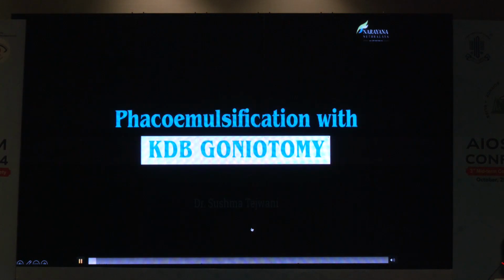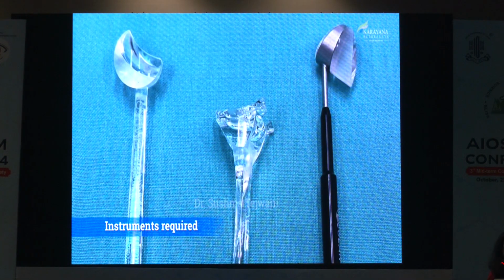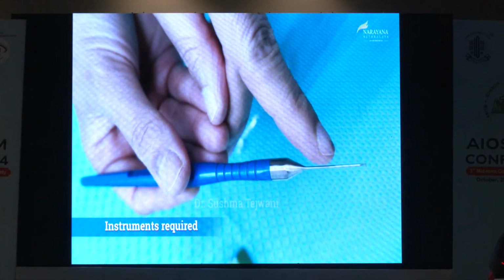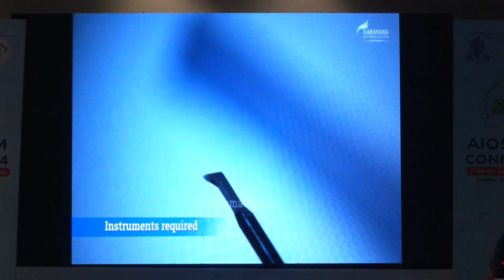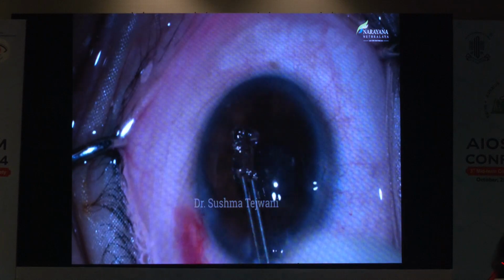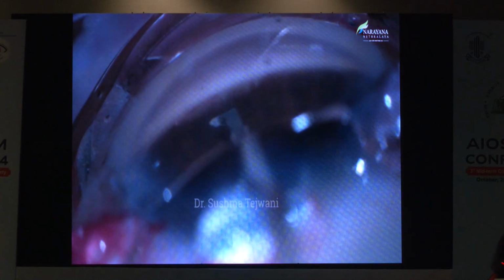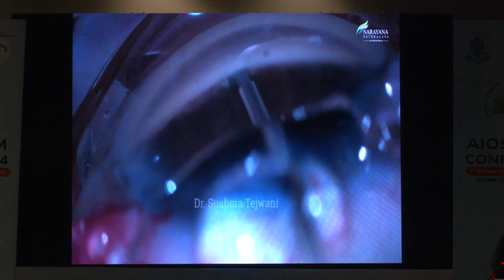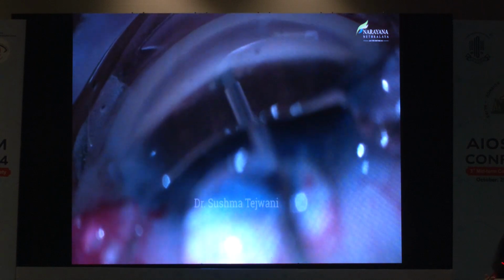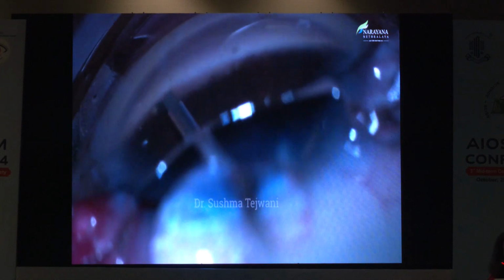The principle largely for focusing an intraoperative gonioscopy is the same. You can use any of the gonio lenses available. This is the blade that you see. It has a tip with two sharp blades so that it cuts the roof of Schlemm's canal, and a parallel strip you can remove. So once you see the angle, you indent the tip inside Schlemm's canal and then move horizontally downwards so as to take off that strip.